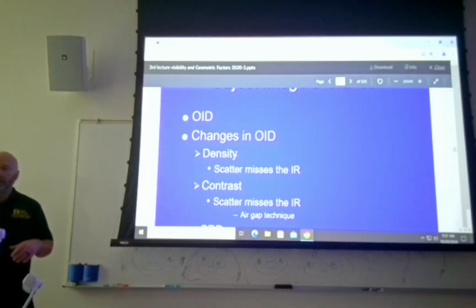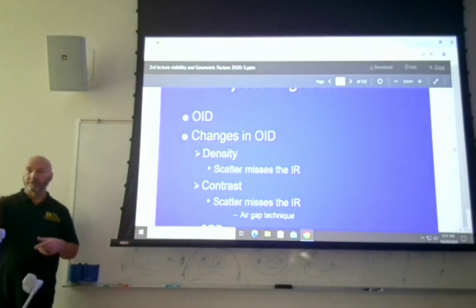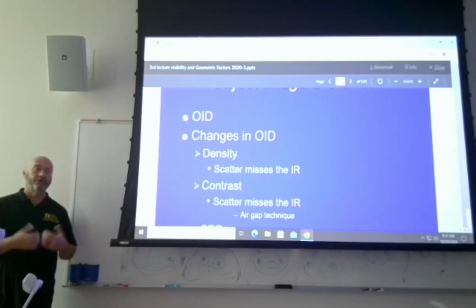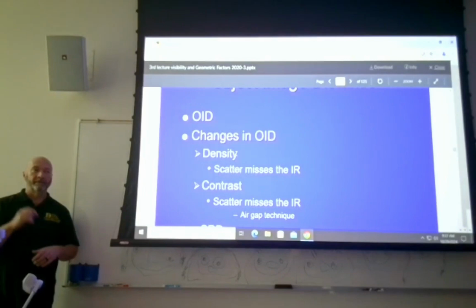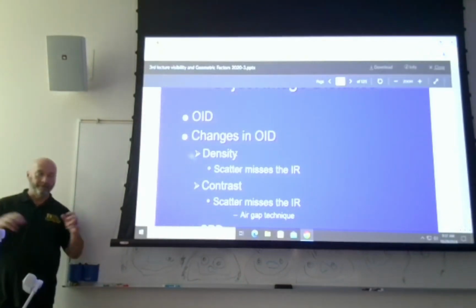So why don't we necessarily have to have a grid for shooting portable chest X-ray? That's penetrating much. Test question. What's that? You're not penetrating much. Well, that's valid. You're not penetrating much. You got a lot of soft tissue. Well, you got some soft tissue and you got a lot of lung, right? But there's a test question that's going to come at you about chest X-rays specifically, and that is because it utilizes a natural air gap.